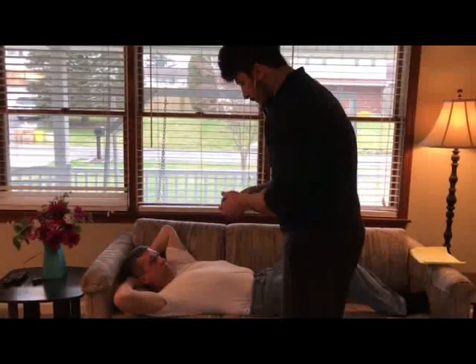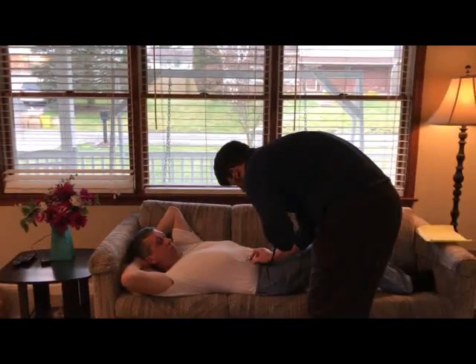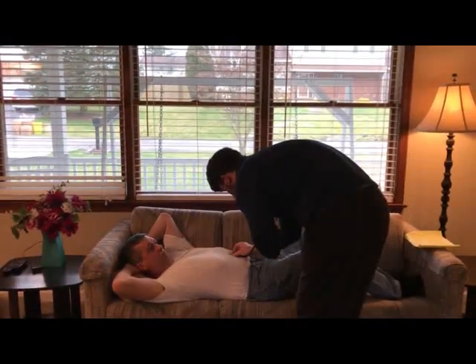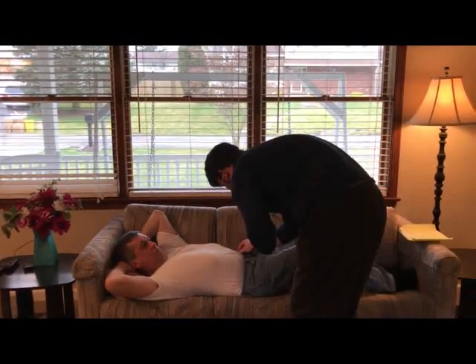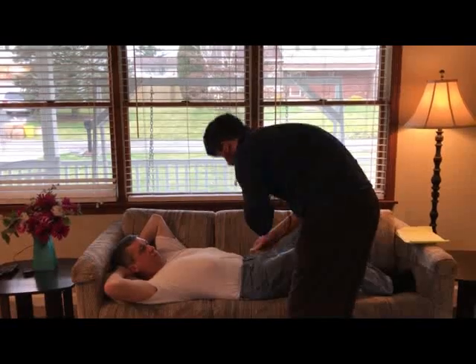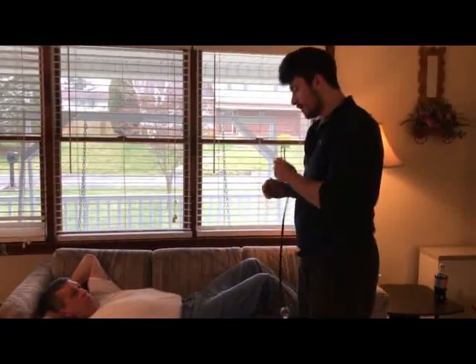Again, starting in the right lower quadrant, using the diaphragm of the stethoscope, we're going to move clockwise. Okay, for time purposes, we're going to keep it short, but everything sounds normal.